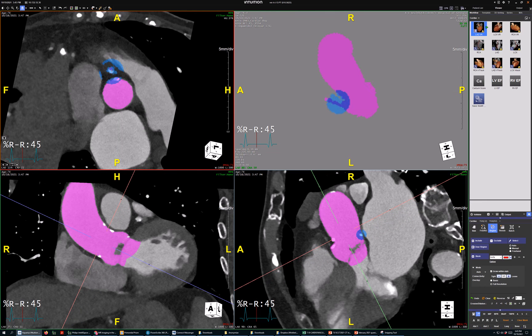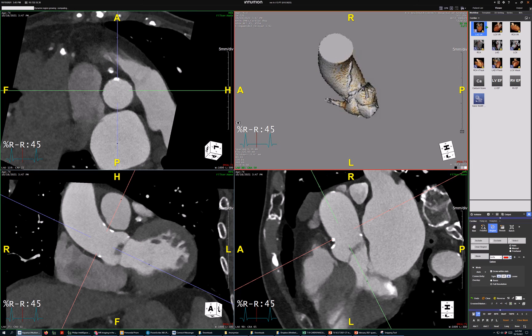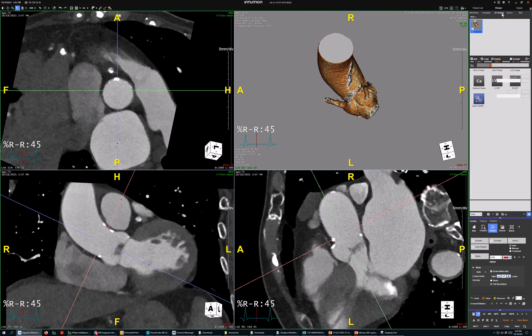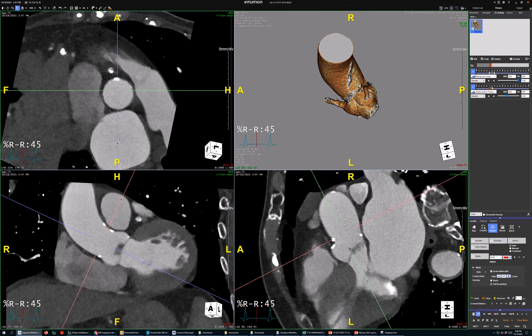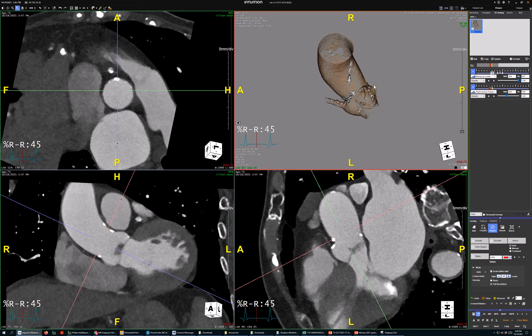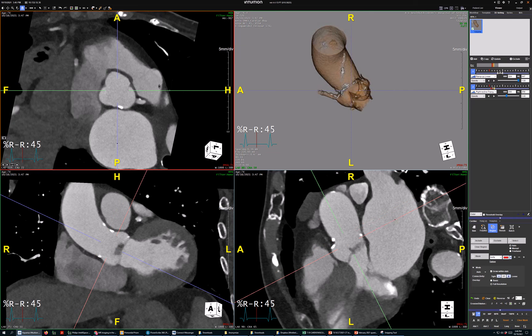There's a little bit of it there — oops, too much. Hit include. Here we've got more or less what we want. I'm going to expand the segmentation by hitting clear, hiding plus one there a couple times. Come here to this setting, move the white slider in the pseudocolor transfer functions higher up, and that exposes the aortic root. We can adjust this a little bit so that it shows the aortic root, the left coronary, and right coronary there.